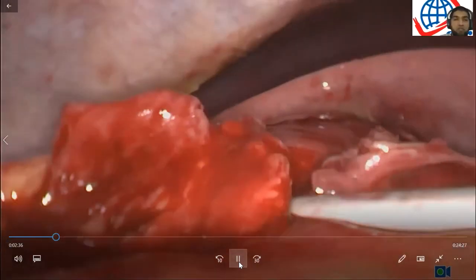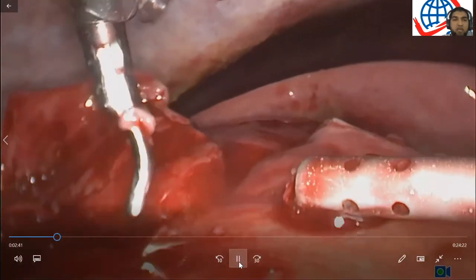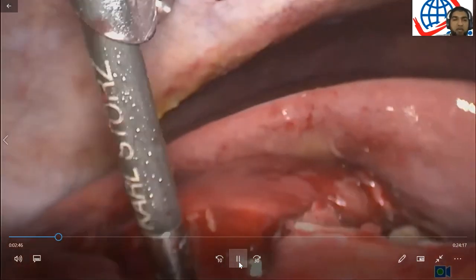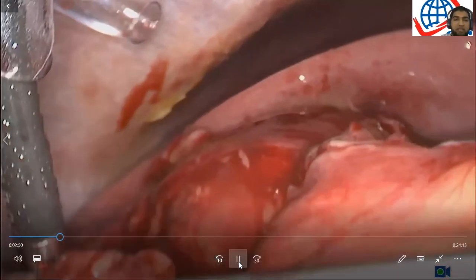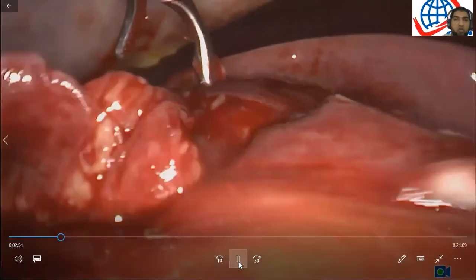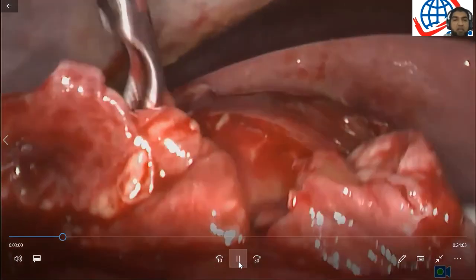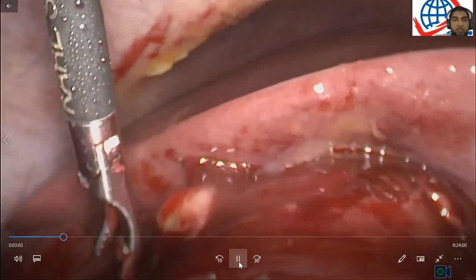I think an important point during dissection is to be quite cognizant of the pressure on your instruments. If you find that two structures are densely adherent, do not force the issue. You will cause iatrogenic injury. Go to another area of dissection, try and make headway in that area, and you find with time, the area that you were struggling with will then be easier to dissect.